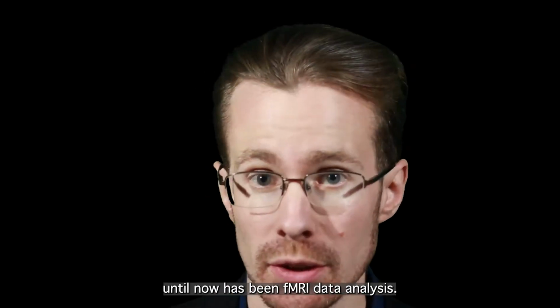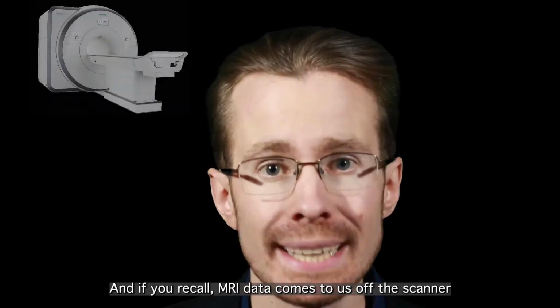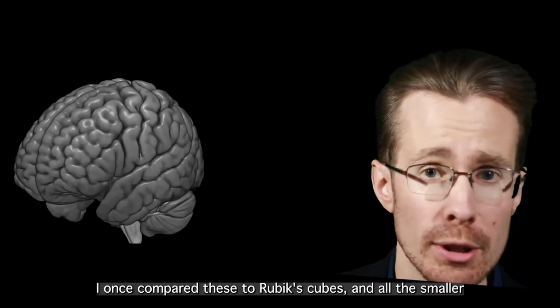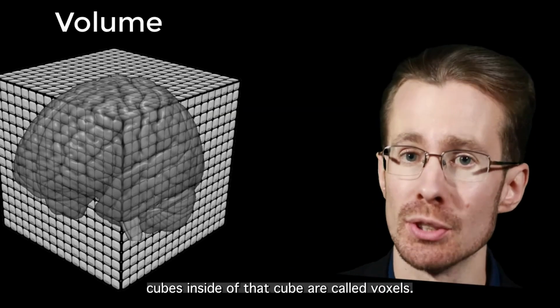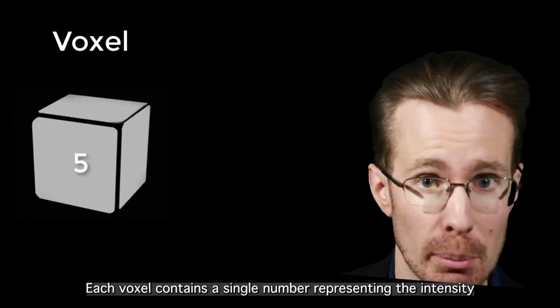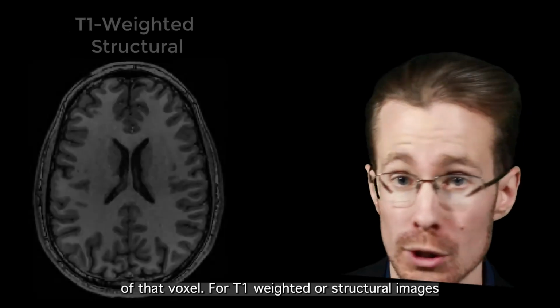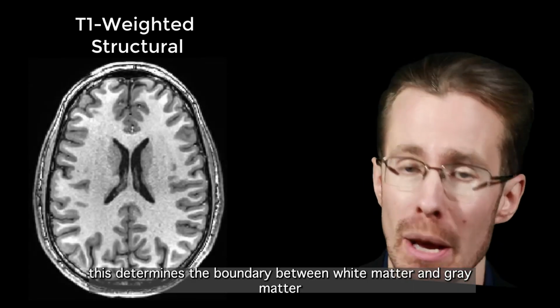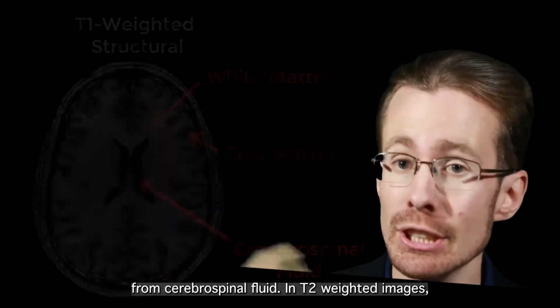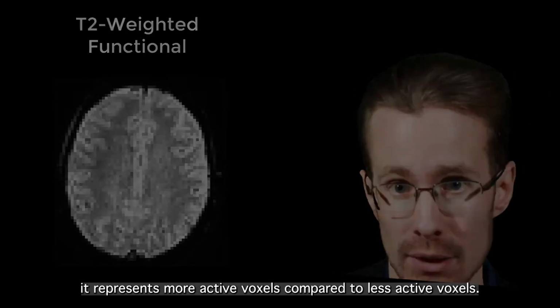Most of what I've talked about until now has been fMRI data analysis. And if you recall, MRI data comes to us off the scanner in the form of volumes. I once compared these to Rubik's cubes, and all the smaller cubes inside of that cube are called voxels. Each voxel contains a single number representing the intensity of that voxel. For T1 weighted or structural images, this determines the boundary between white matter and gray matter from cerebrospinal fluid. In T2 weighted images, it represents more active voxels compared to less active voxels.